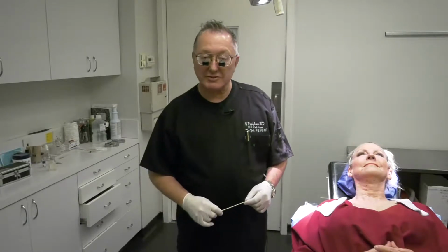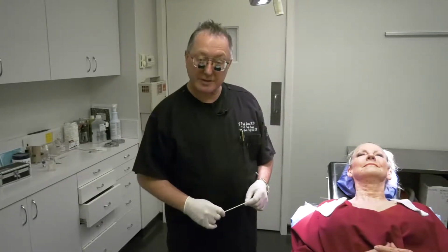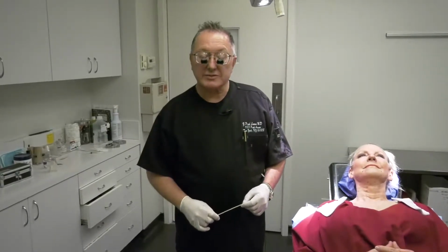Hello, I'm Dr. Paul Lorenc, and today I'd like to demonstrate injection of the platysma and the lower muscles of the face using a neuromodulator. In this case, we're going to be using Xeomin. The dilution that I use is 50 units.